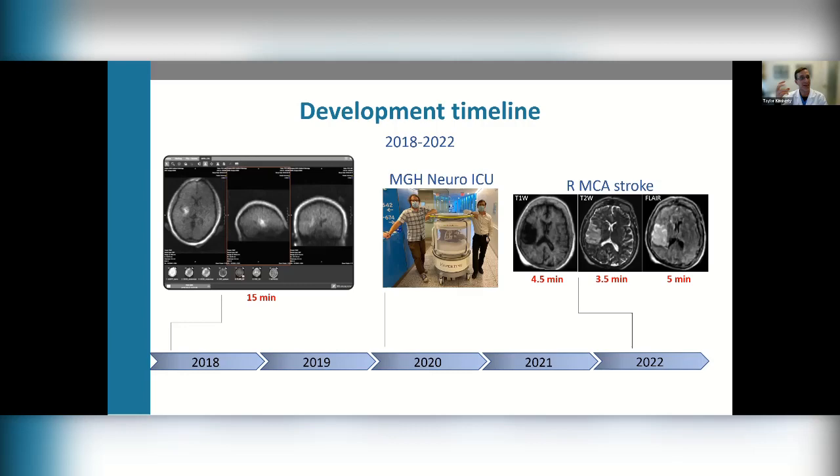And there's always an interaction between each of these. Generally, you can't tip the scales towards one without affecting one of those other factors. And that's always been the challenge in figuring out how to apply, frankly, MR in any scenario, but certainly applies in the low field regime as well.